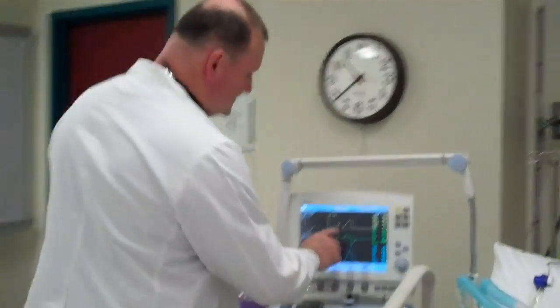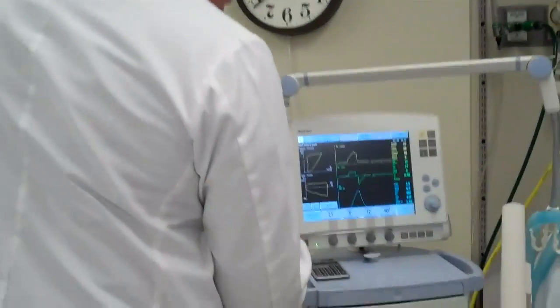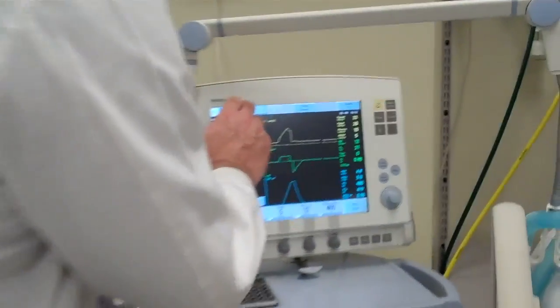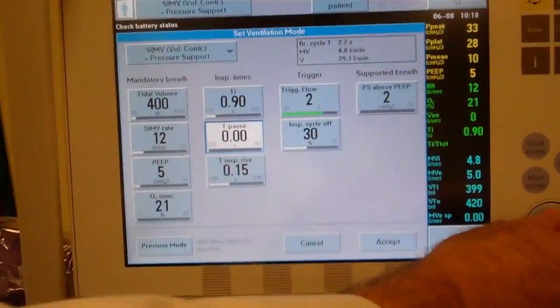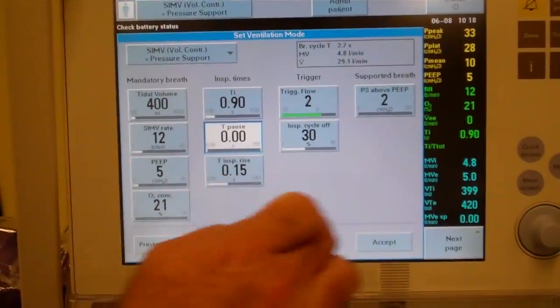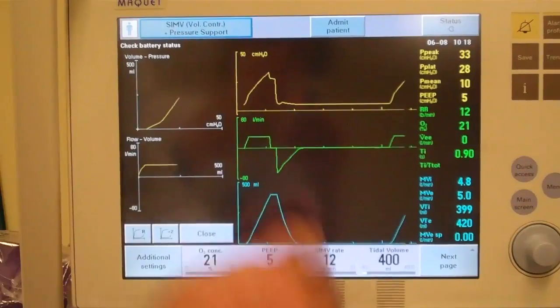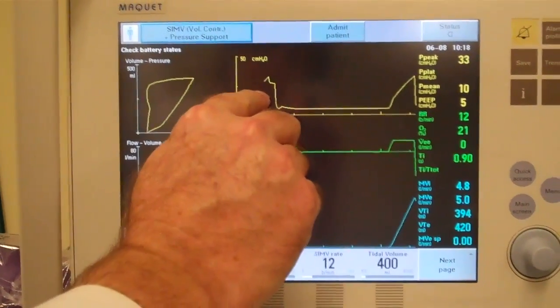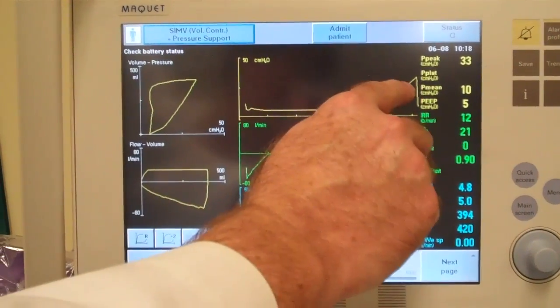Right now you can see that we have the pause pressure on, so I'm going to go to the setting screen, take the pause pressure off, and accept that. Now you can see that we no longer have a pause.